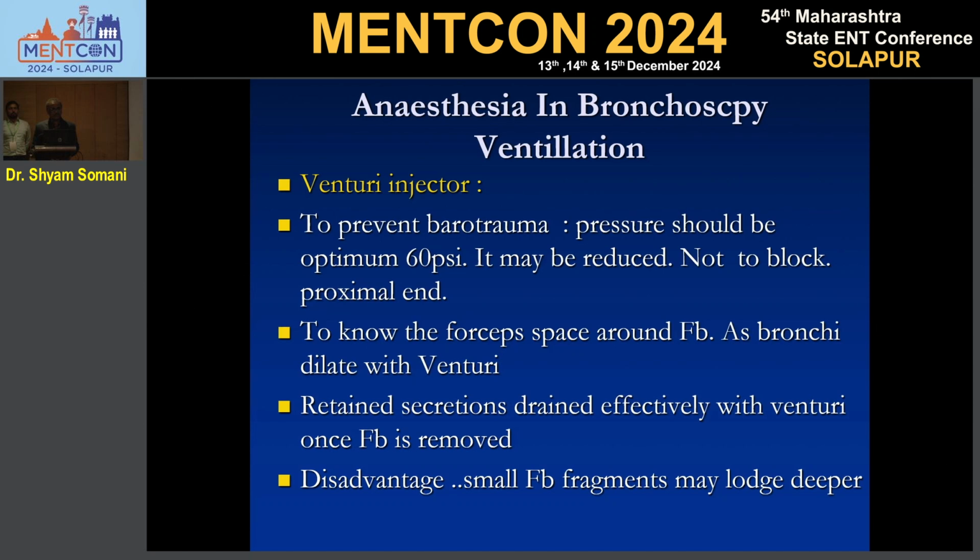Now Venturi itself helps in so many ways. You can reduce or decrease the pressure depending on your desire from 60 psi, it may be 10 psi, 20 psi. There is a regulator and you can reduce the pressure also. Venturi can be used to dilate the bronchial tree so that you can get the space for catching the foreign body, that is, forceps space.